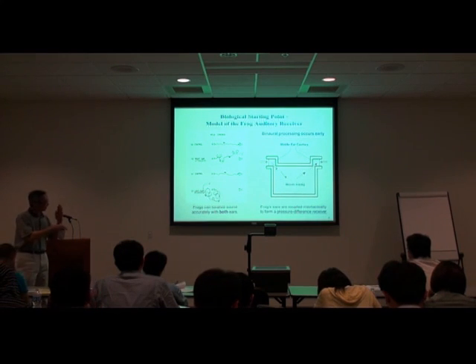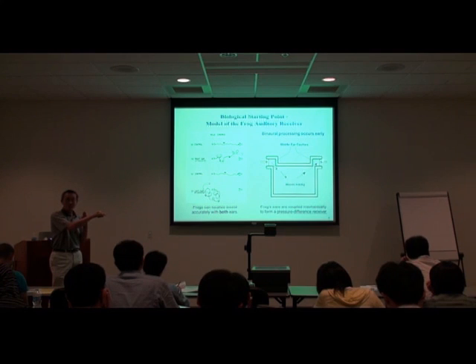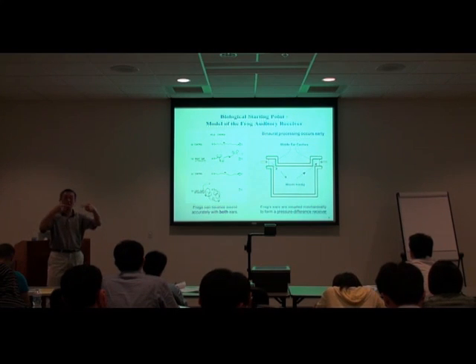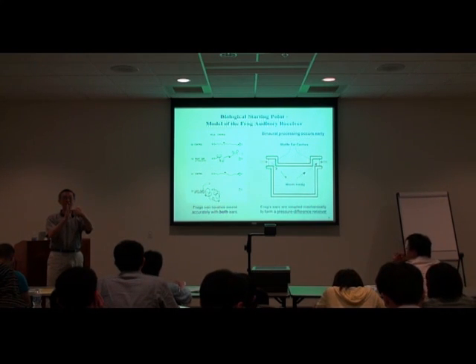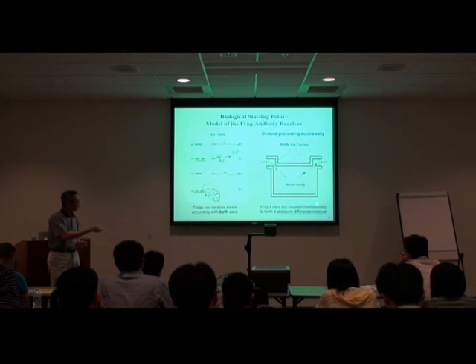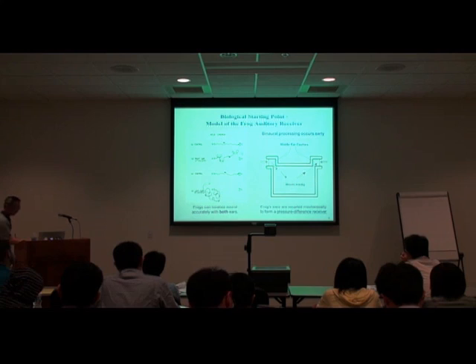So the push-pull receiver basically is a pressure difference receiver. The pressure from the outside is bigger than the inside. When the two pressures are equal, basically you have none. So it becomes very insensitive to sound coming from the straight-ahead direction. And this pressure difference receiver principle is what we use in our design.